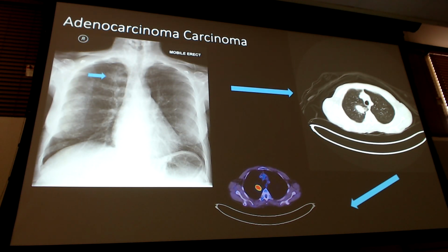Okay. Another one, kind of fuzzy. Recognize it's not necessarily super peripheral, like we talked about, but it's also not connected to the center area. Even on the CT, you can see I've got a nice little bit of lung tissue completely surrounding it, so I'm not connected to that central mass. That's really what peripheral means. It means not connected to the central structures.